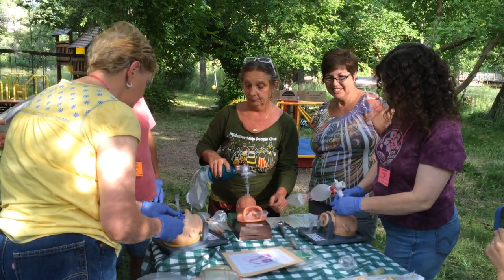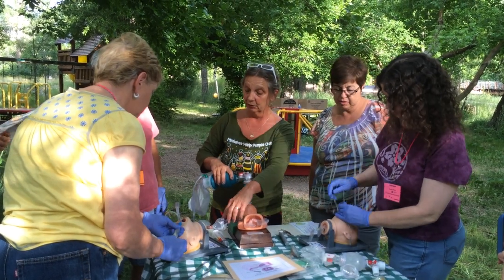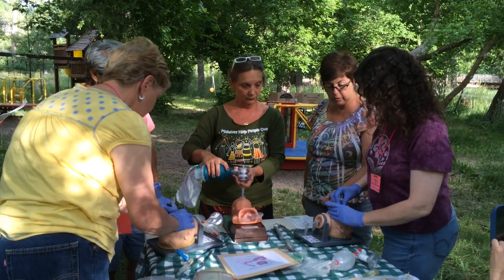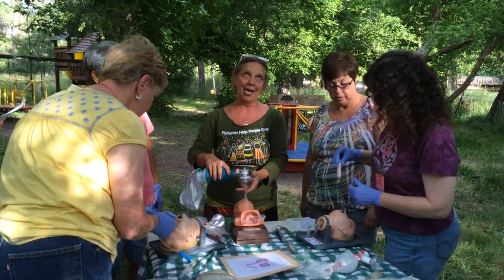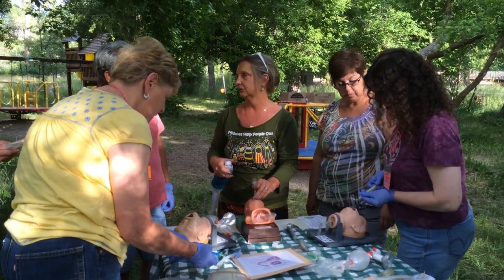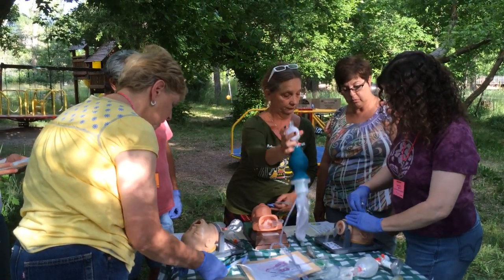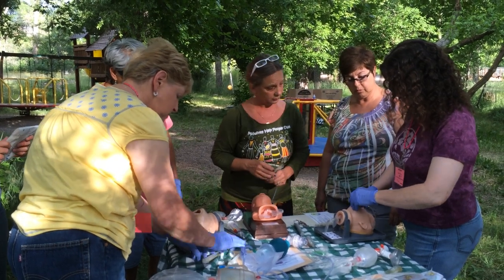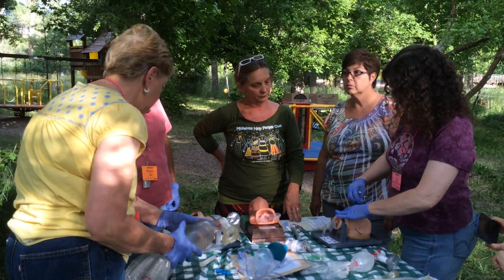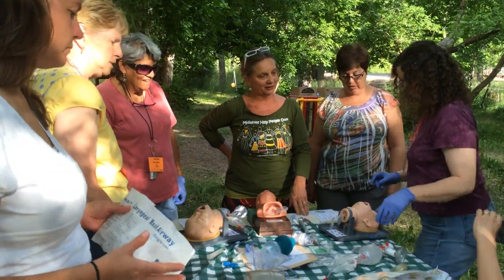So, when you're ready to take it out. Did you get it? Great. So when the baby starts waking up, then you go ahead and take the air out and take it out. A lot of times they'll just spit it out. Did you take the air out first? Yep, just pull it out. Feel a lot better once it gets out.